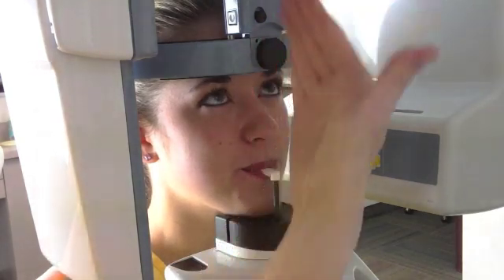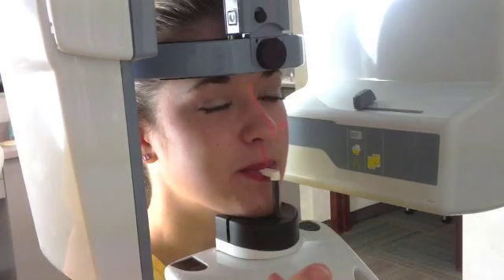Then we shine a little red light down the center of the nose. We want to make sure that's centered so we can get the correct x-ray centered.